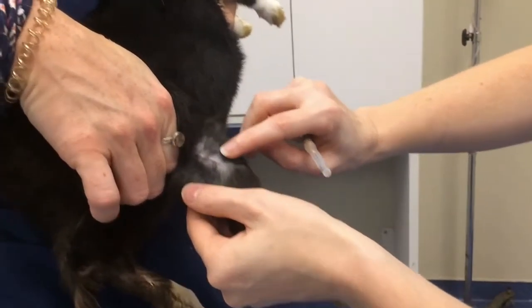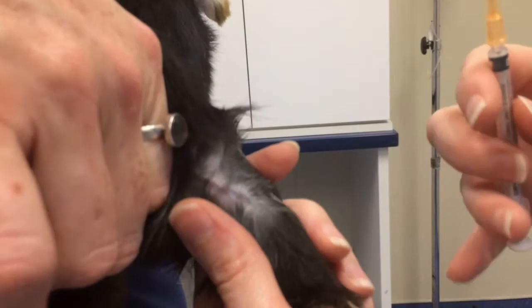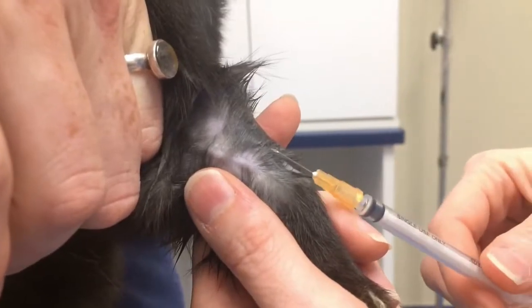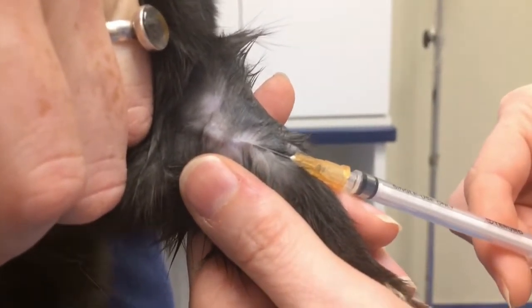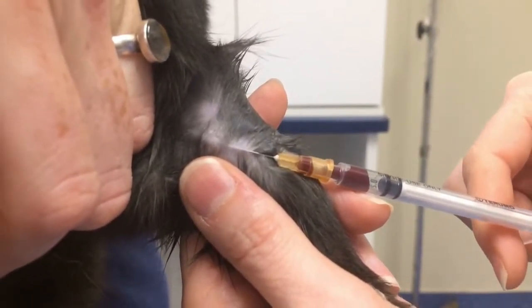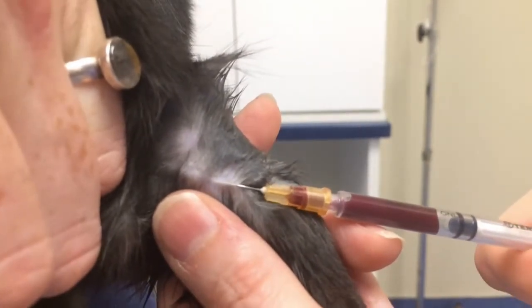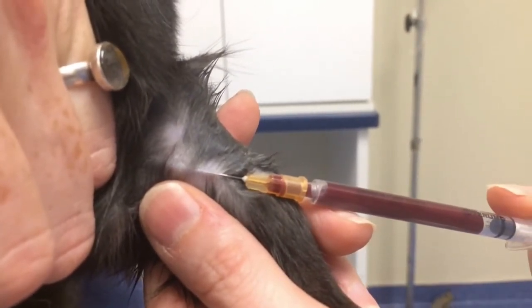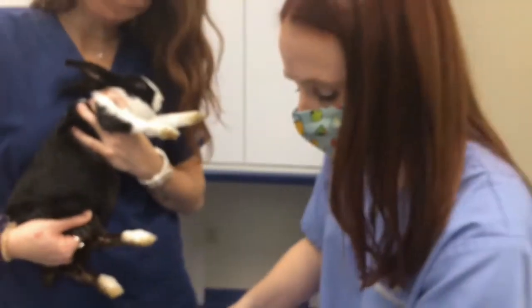Now that we've got a really good view of our vessel, we're going to go right in. It is very superficial, so I usually gently hold along the leg and support my thumb over here. Always go ideally bevel up — just a little poke right under the skin here. It looks like I'm just to the side of it, so we'll redirect a little — and there you are. Sometimes it's helpful to angle your needle down against the body, as angling it up can prevent the blood from flowing as nicely. This was a great blood draw. Kate is just going to hold off, gently pull off, and go ahead and put those in the tubes.